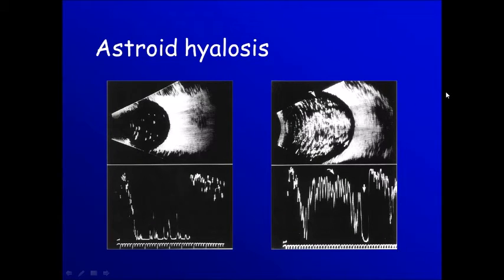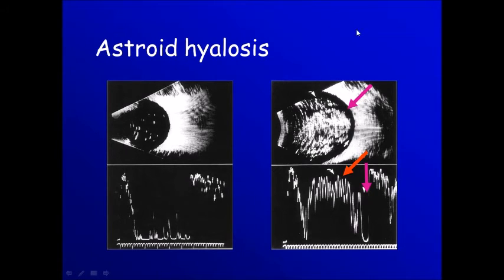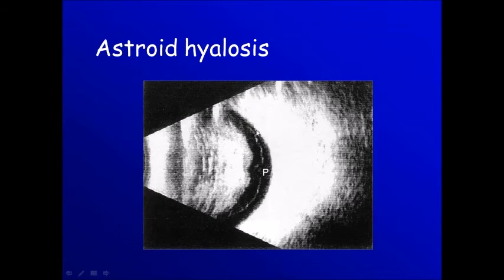The last thing is asteroid hyalosis, where we have calcium deposited in the vitreous cavity. As you notice here, the reflectability is high. A second character is that the most peripheral part of the vitreous is free of these calcium dots. So here we have a posterior vitreous detachment — this is the peripheral part of the vitreous and it is of low reflectability compared to the area where we have the calcium.